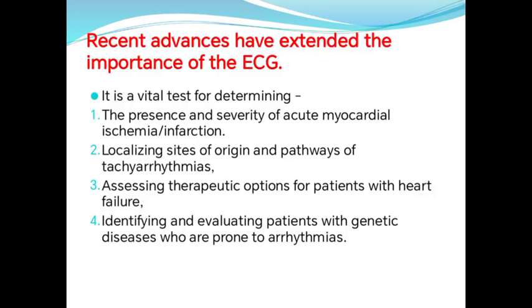Number four, you have some hereditary problems of the heart, some genetic diseases causing arrhythmia such as Brugada and channelopathy. You can use the ECG to diagnose such problems.